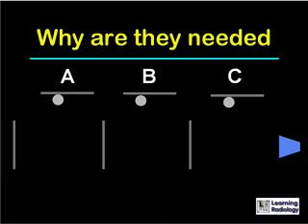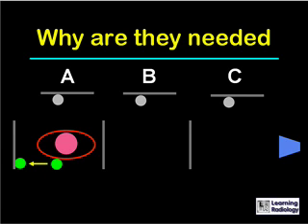And so we'll add another view at 90 degrees to the first, an orthogonal view represented by the vertical gray stripes. And in the case of patient A, we can see that the lesion is projected in that location on the X-ray cassette.